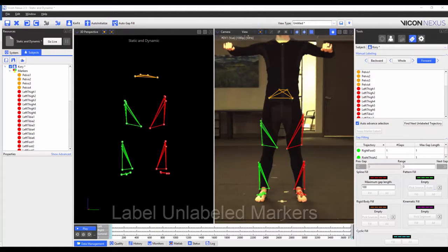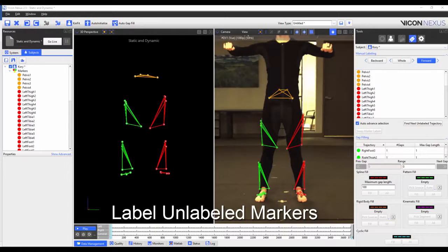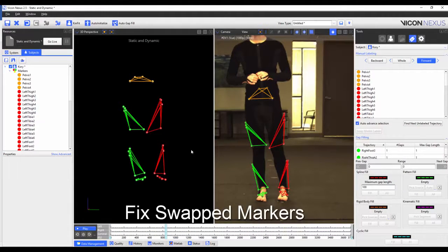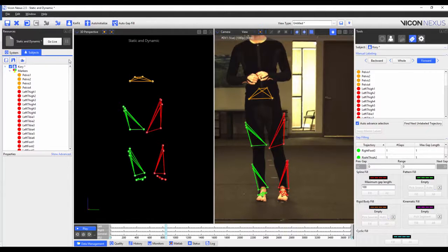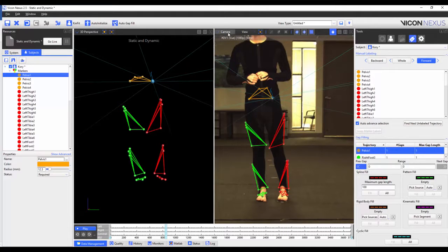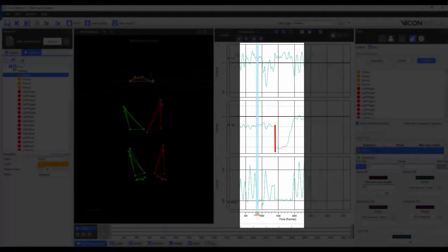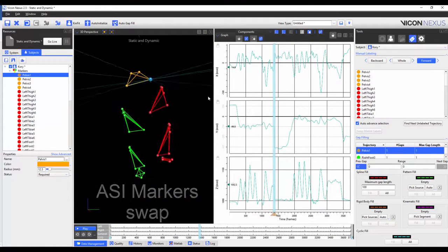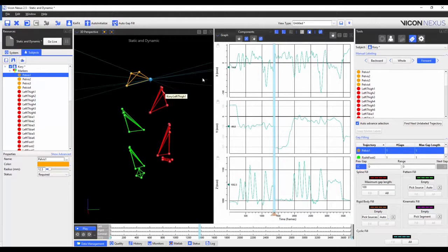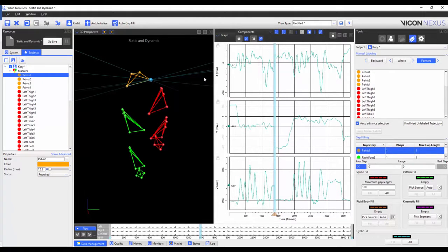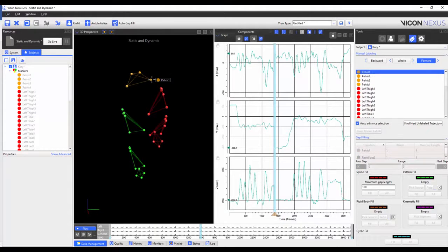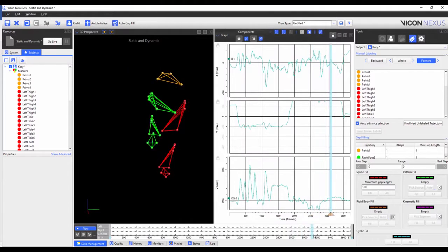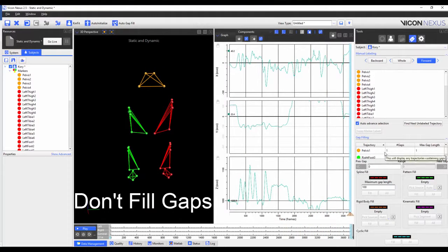I'm now going to go through the trial and make sure that my markers are correctly labelled. This means that if markers become unlabelled, I label them properly. If markers switch, I switch them back. To illustrate the point, I know that my two ASI markers switch. I can check this in the graph view, where I can see that there is a large jump in the Y axis, which is not accurate. I'm going to make sure that I fix the labelling for the remainder of the trial. Although I do have gaps, I'm not going to fill them.